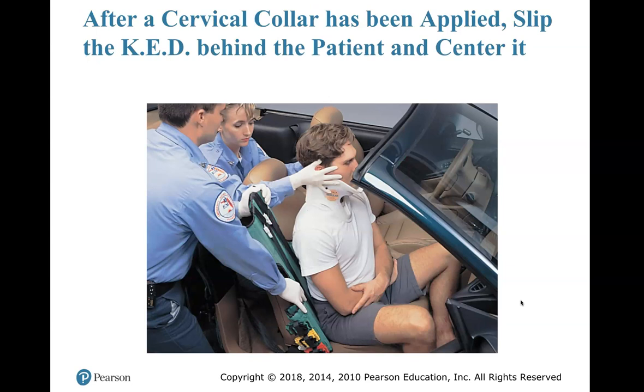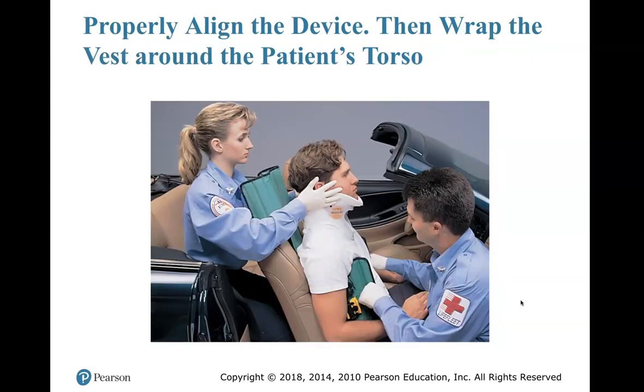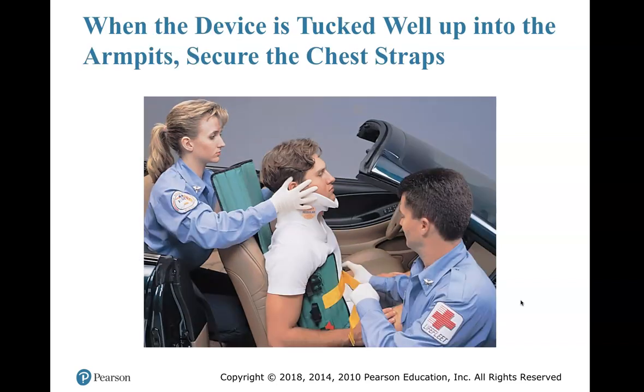Okay, you see them sliding the board in. See, that cervical collar is already in place. You see that EMT in the back seat holding that inline stabilization, because that patient, just the way it is, especially us living in the South, those patients are going to want to help you do your job. And we don't need them moving around, looking around with the spinal injury.